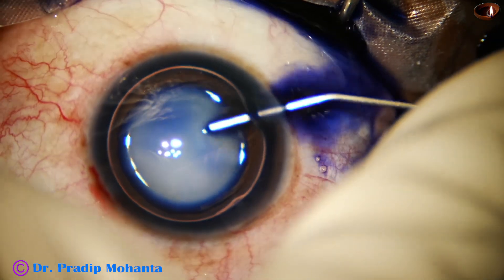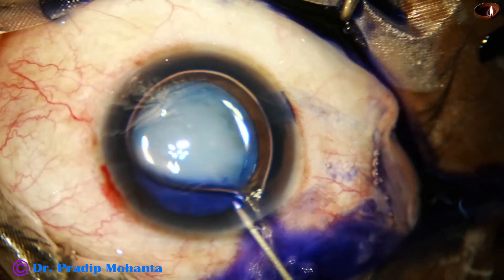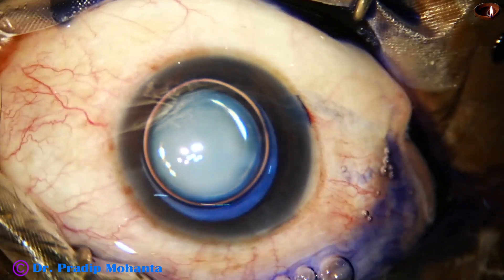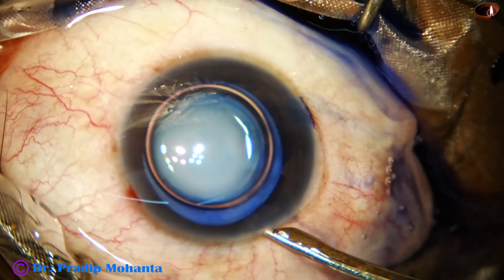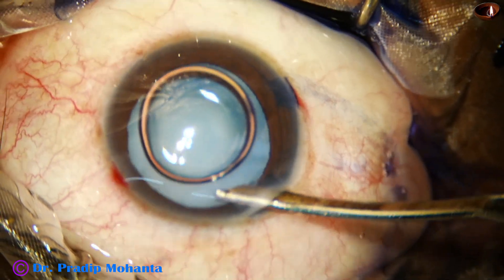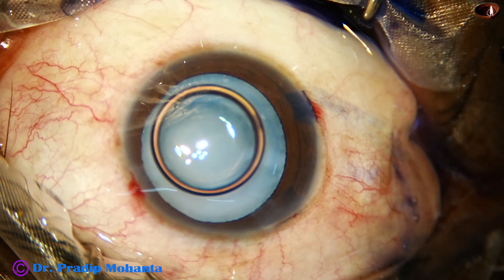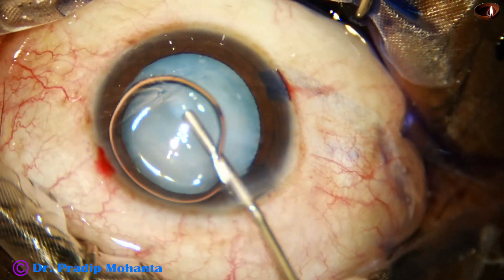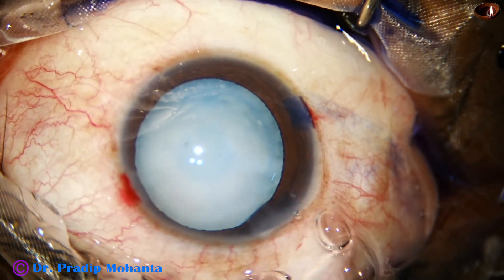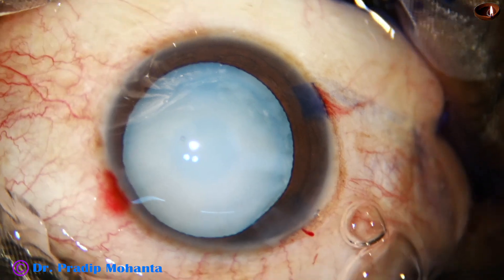Now the anterior capsule is stained with trypan blue dye underneath an air bubble. A little bit of adrenaline is injected to maintain the dilatation of the pupil during emulsification of the nucleus. Excess dye is washed out with Simcoe, and now the anterior chamber is filled up with 2% hydroxypropyl methylcellulose.